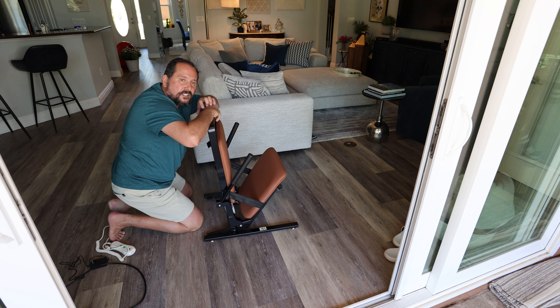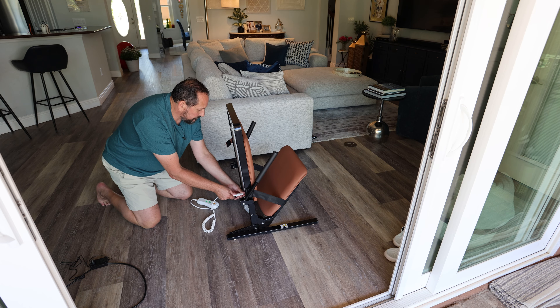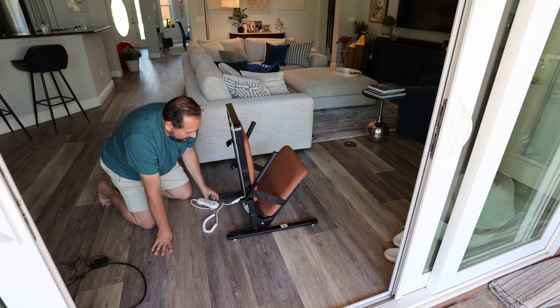It has this remote, which has really nice big buttons — up, down, stop, three functions, that's all there is. You just connect it here; there is only one way this connects, and it snaps right in like that.